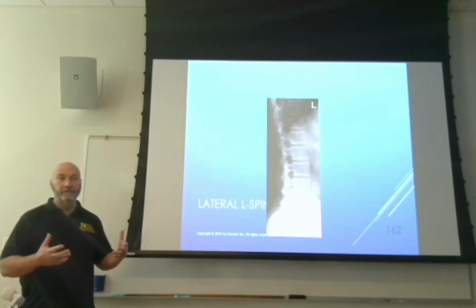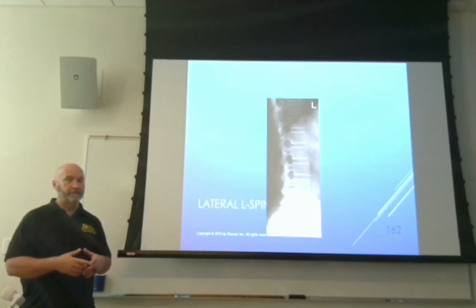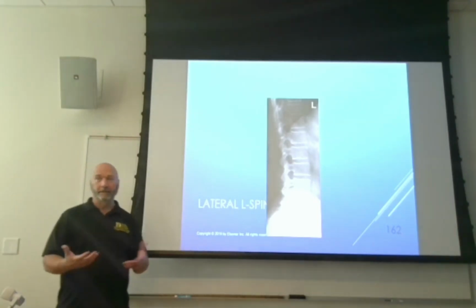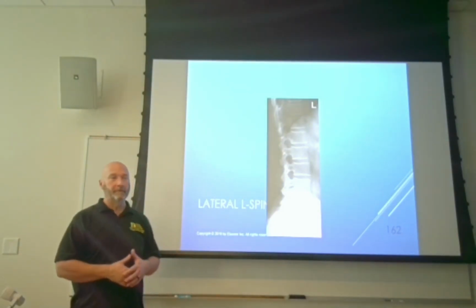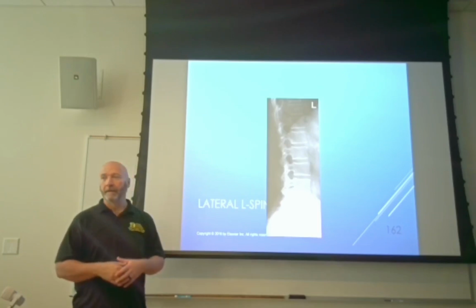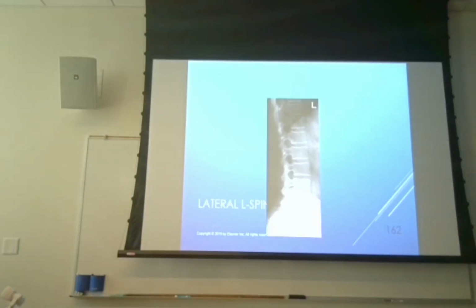If you ever see anything like that in a patient, it needs to be brought to the radiologist's attention while the patient's still on the table. Say, I think you need to take a look at this. If we'd have injected that patient, increasing that blood volume, the patient probably would have been dead on the table in about 10 seconds. It was massive. The aneurysm alone probably had a liter of blood in it. It was huge. So we sent the patient over to CT. They did CT on the patient. The patient was in surgery the next day to take care of that aneurysm.